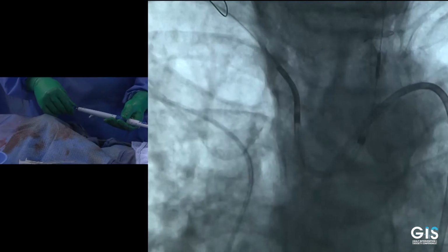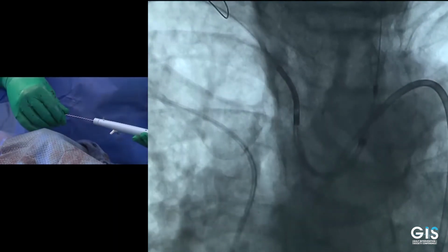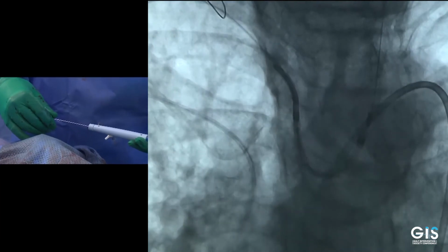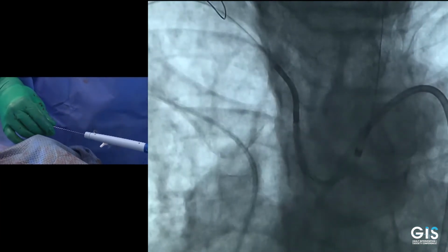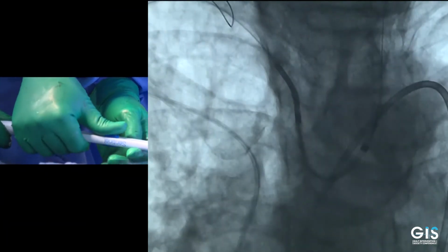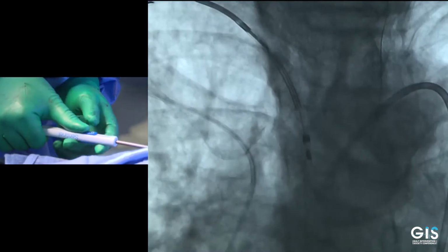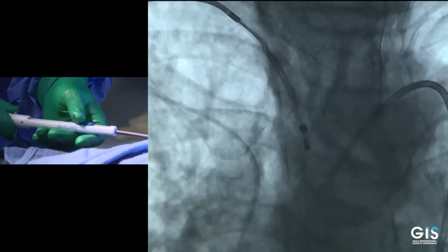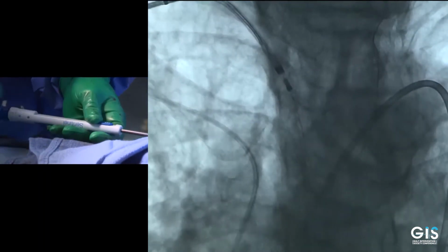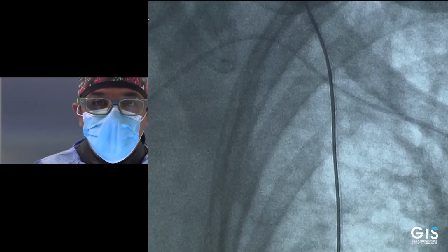Okay, yes, keep going, fantastic, all the way. So now you could pull the system slightly, yes. So we bring the system together, we close the second basket, the proximal. Now you just retrieve the whole system. And if we find anything that has been retrieved, we'll show it to you at the end of the case.